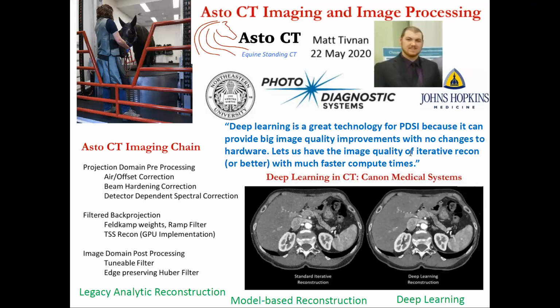And you get the quality of image reconstruction you can get from iterative reconstruction with a lot faster speed and even some better quality, depending on the particular limits of what it is you're looking at. We'll get into all the details about that. But this is a recent development.